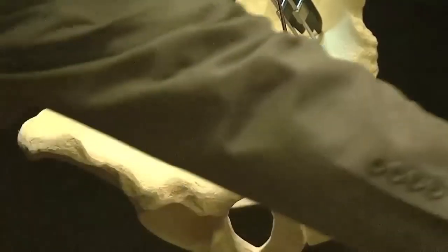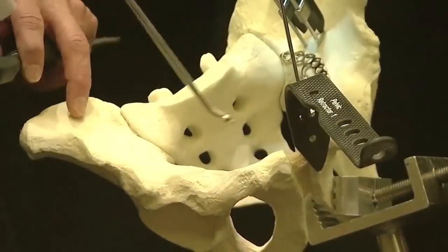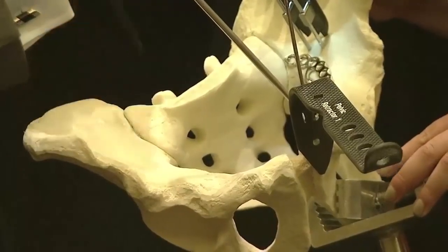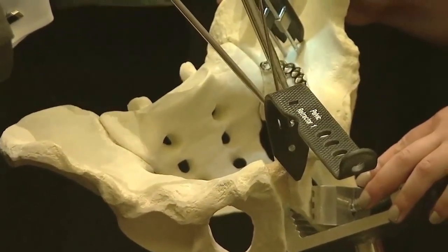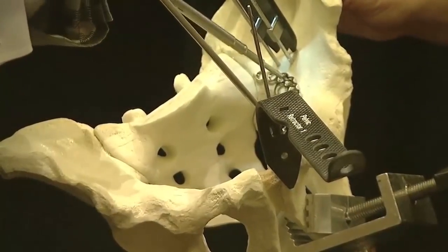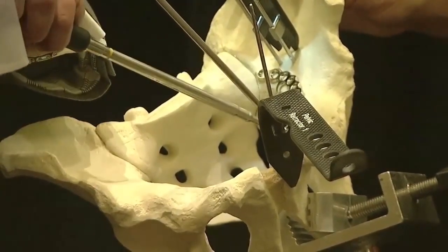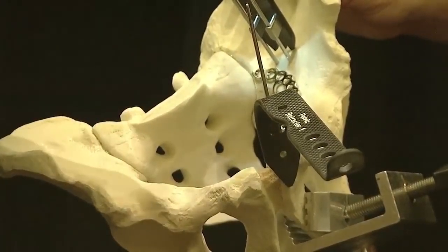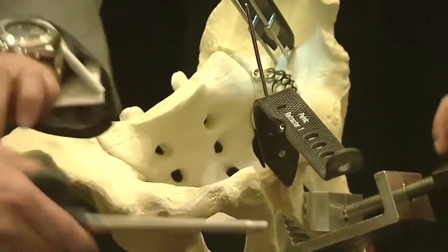And if we need to, we can use the ball spike to maybe position the plate a little bit more. Say we're going to move it over like that, and we can put a second screw in a similar manner. We line it back up, and we can put a screw in. And we can work our screws around underneath the nerve, which Claude will show you, or along the pelvic brim, using this plate screw inserter.